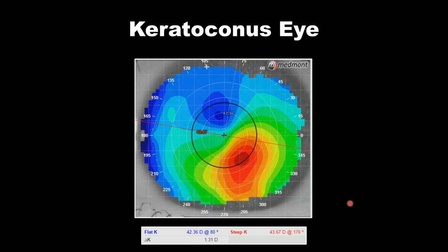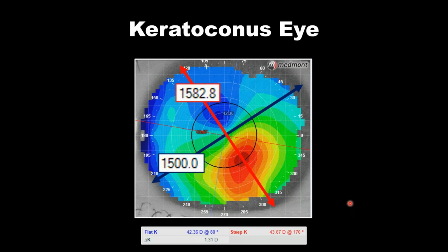Okay, now what about the keratoconic patient? What do we do with sagittal differential for this eye? Well, there's really no difference. We still want to understand sagittal depth, and we might take the meridian of least action or the most symmetric meridian. We're 1,500 microns here. If we go across the steep, we're 82 microns deeper when you average the elevation here and the elevation over here. Of course, asymmetric. And then we get another height differential here, another height differential here.